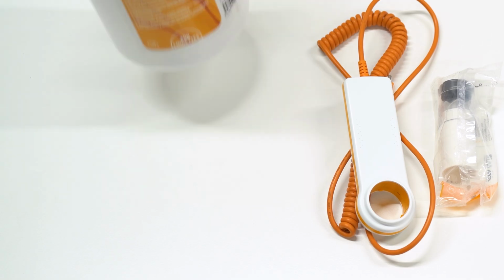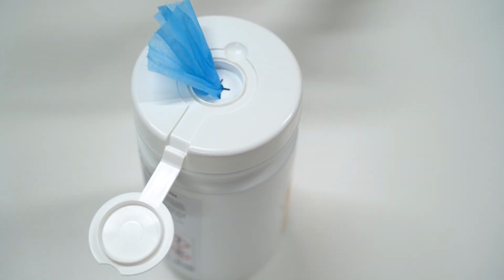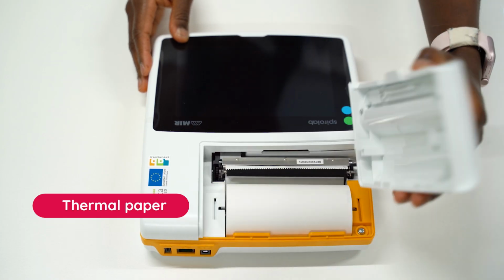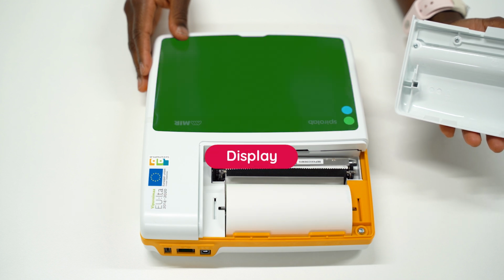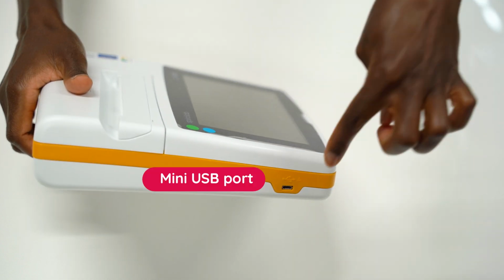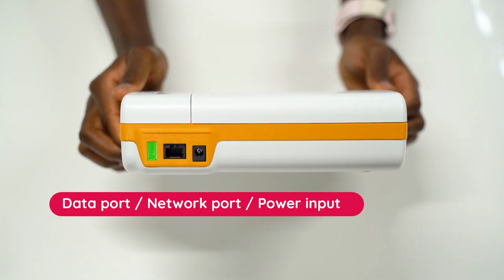Sanitary wipes to clean the device between uses, minimizing cross-contamination. Components of the device: thermal paper, display, mini flow meter port, mini USB port, network connector, and power input.